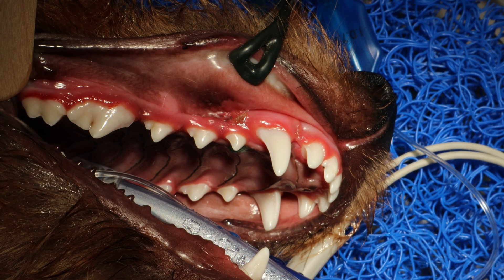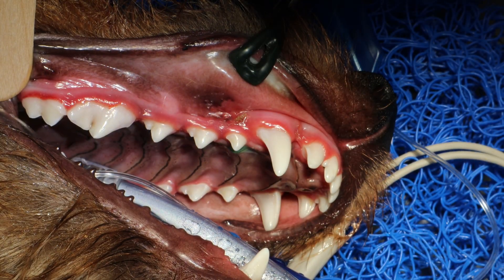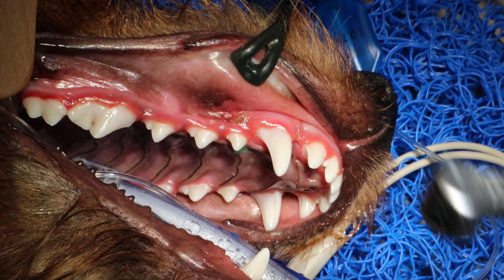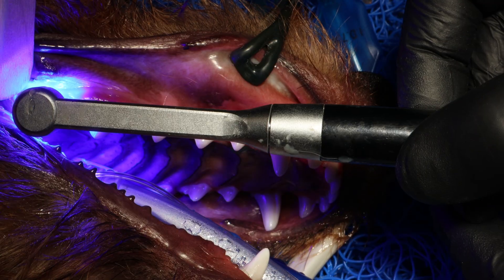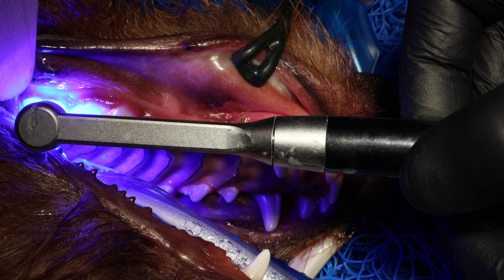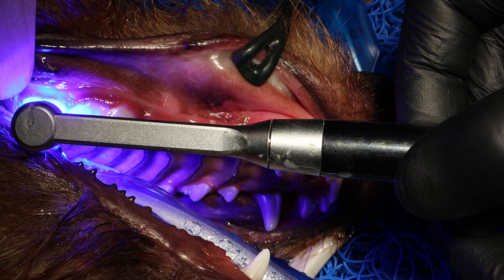So you gently rub it in, and you'll see the hair moving now. That's because I'm air drying with my three-way air-water syringe, just to evaporate any solvents and to make the layer a little bit thinner, because you want the bonding layer to be as thin as possible.